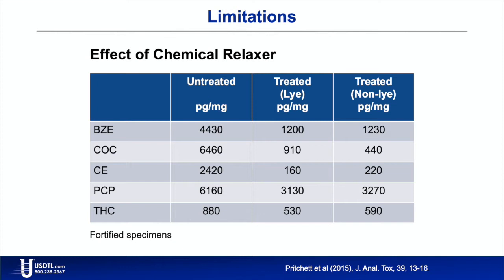So any hair that's cosmetically treated, we have to be aware that in these particular samples, most of the compounds were reduced significantly. These were above the cutoff, but we have to be aware that if someone was just above the cutoff, these treatments will knock the concentration down below the cutoff.